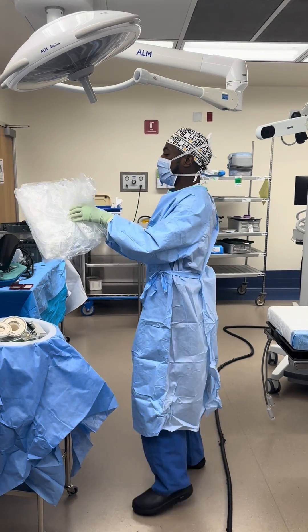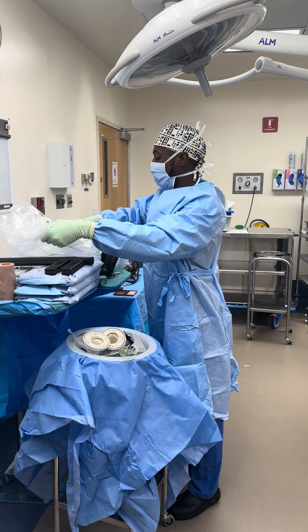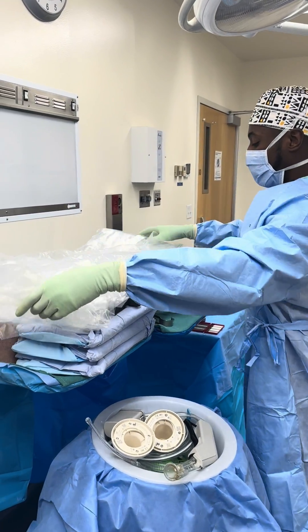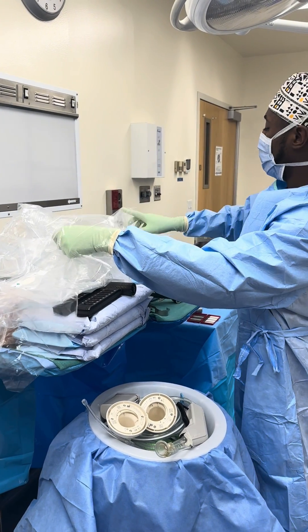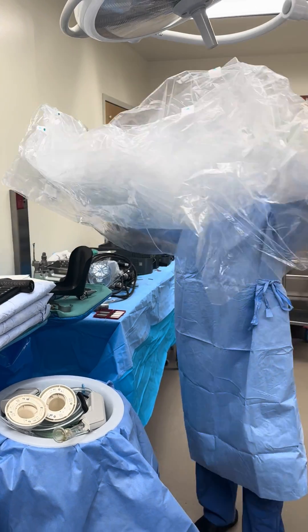Here's the drape. A lot of times it's easier to open it up on the table — open it up like that. I put my hands on the inside of the drape, grab it like that, and bring it over.